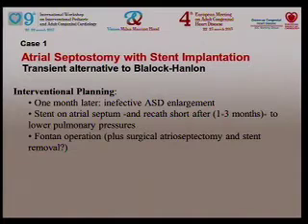So in the follow-up, we found that 1 month later, this dilatation had been ineffective because the pressure gradient between both atria rose again. So we decided today, as an interventional plan, to place a stent on this atrial defect and try to recath shortly after to effectively confirm that the pressures are lower, to try to complete in the future the Fontan operation.